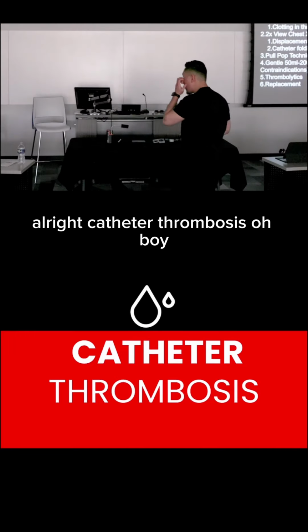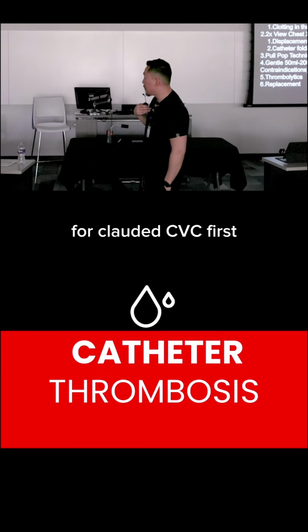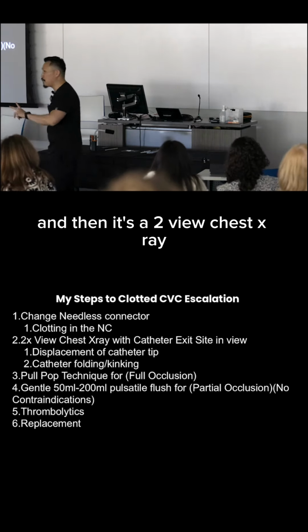All right, catheter thrombosis. Oh boy! Here are my personal steps of escalation for clotted CVC. First, I change the needleless connector because that's the easiest, cheapest way to fix this issue and it's pretty common. And then it's a 2-view chest x-ray.